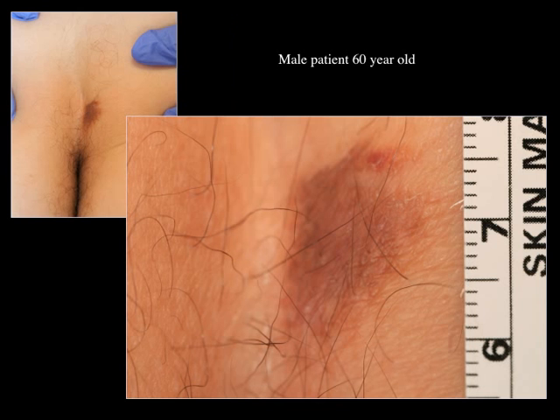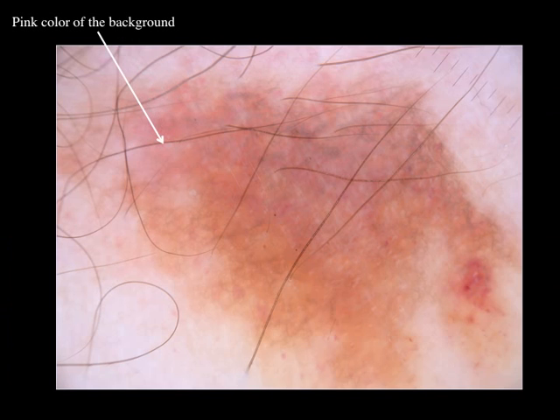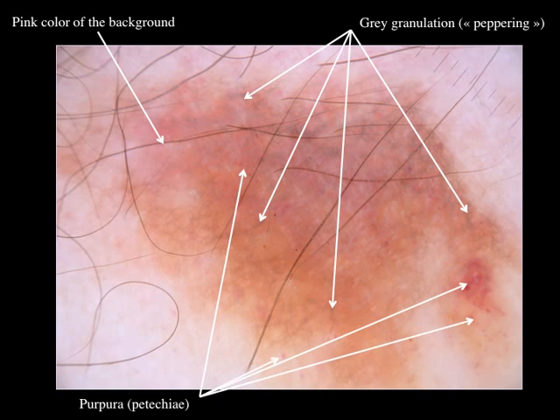This is a close-up and this is dermoscopy — contact dermoscopy with pressure. The background is pinkish. You can see grayish dots in different parts of the lesion, with sometimes a granular annular pattern. This grayish coloration is prominent and observed almost everywhere, and there are red dots that are not erased by pressure, so it's purpura.